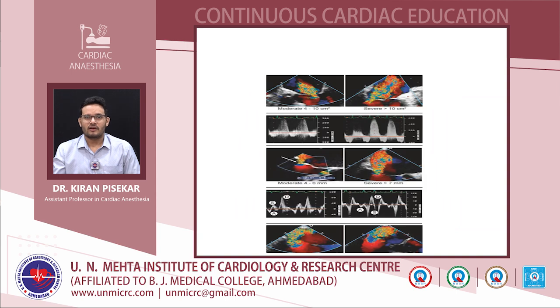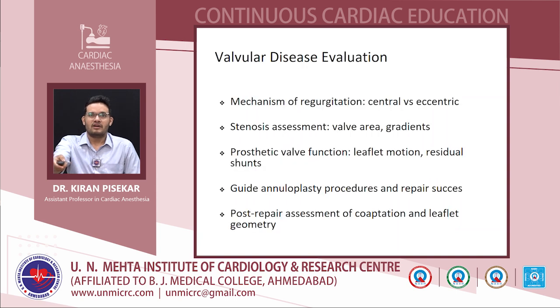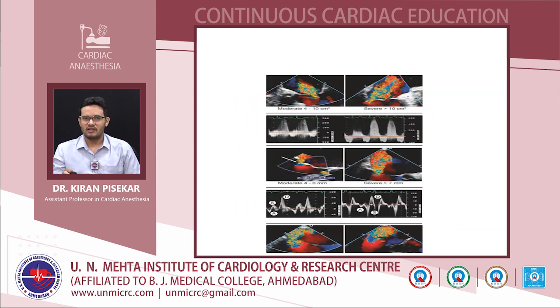So in repairs, TEE is very essential for pre-op and post-op assessment. Post-op repair assessment of coaptation and leaflet, we'll discuss further. So these are the basic views and modalities. This is a mid-esophageal 4-chamber view, and this is an aortic long axis view.